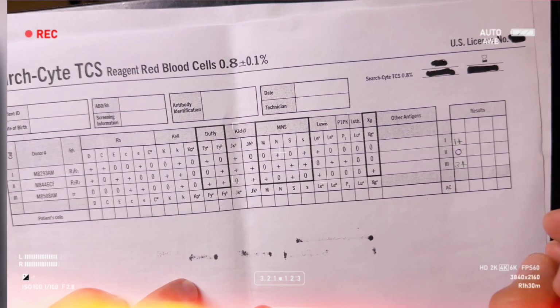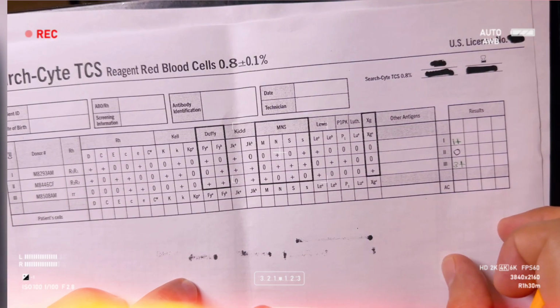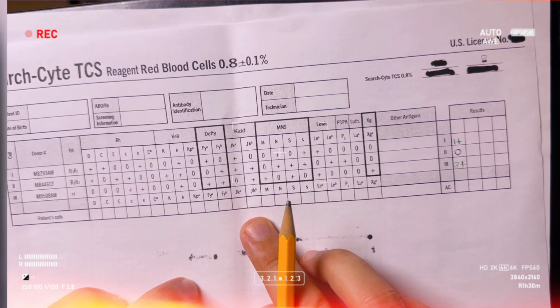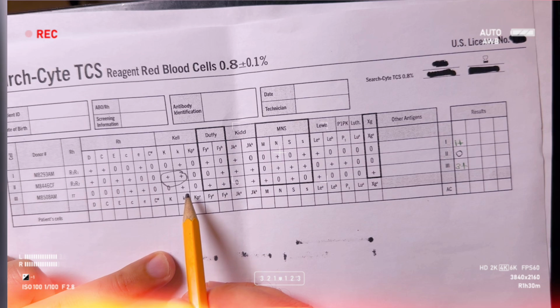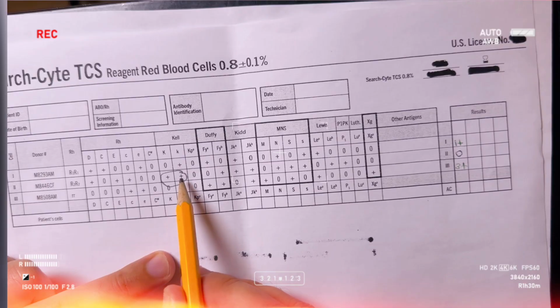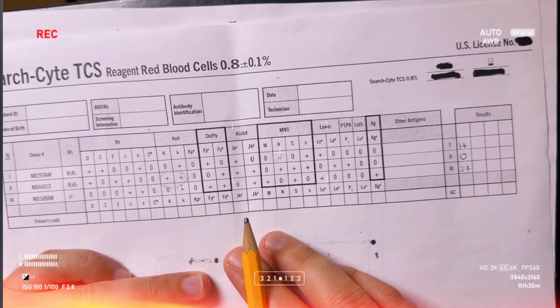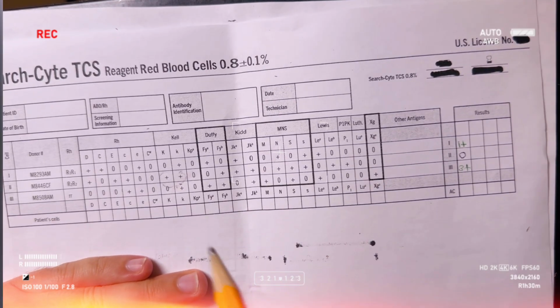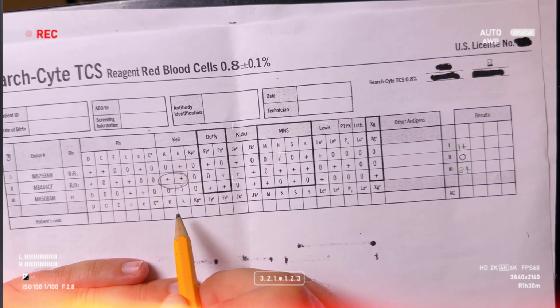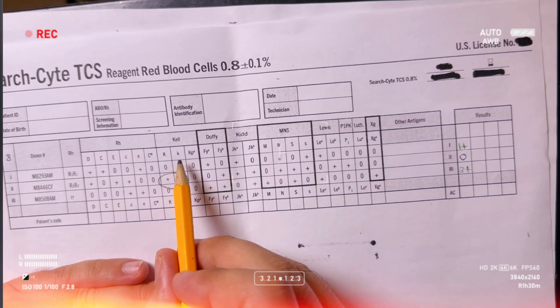Before we start the rule out and rule in, I want to let you know there are some rules you have to use to solve the puzzle. The rules are to use only the 0-cell reactions to rule out antibodies. Another most important rule is that you can use 2 heterozygous cells to rule out antibodies: when the same antigen has two reactions, that's called heterozygous. So you can use the 2 heterozygous to rule out the specific antibodies.